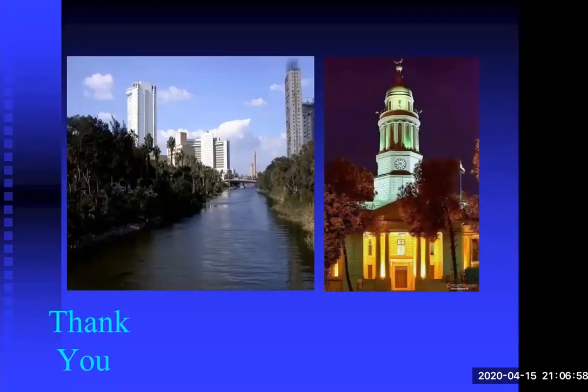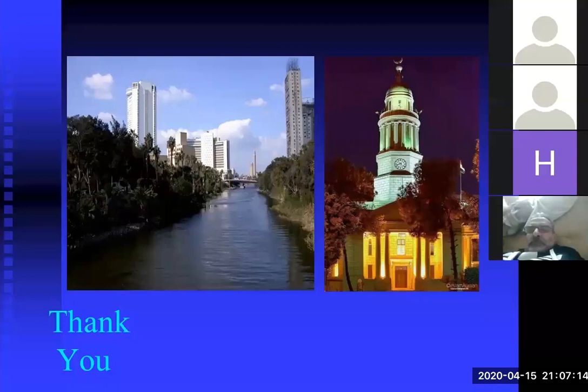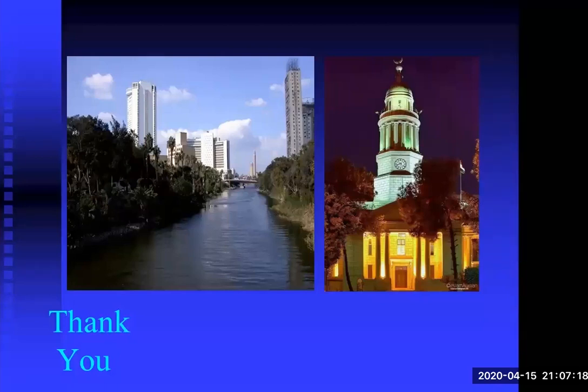Do you prefer using EUS balloon? No, I don't use the balloon. I haven't for 10 or 15 years. I think all the world stopped using the balloon, but some centers are still using it. The problem with the balloon is that sometimes some air enters inside, and even a drop of air can mask the field. So we should suck it out again and inflate it again.